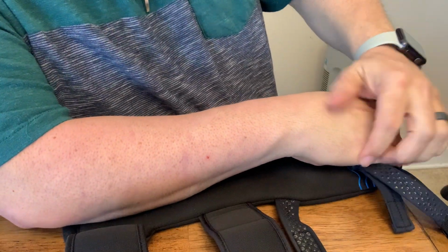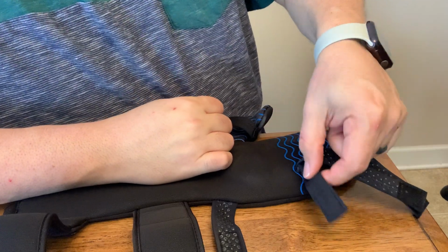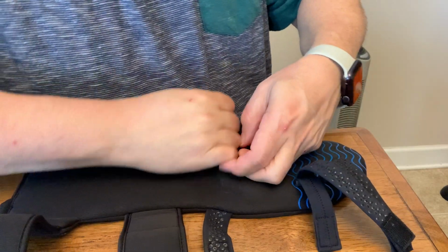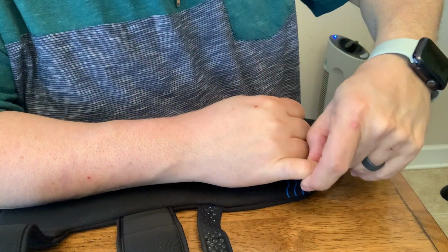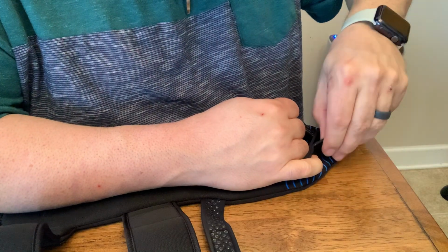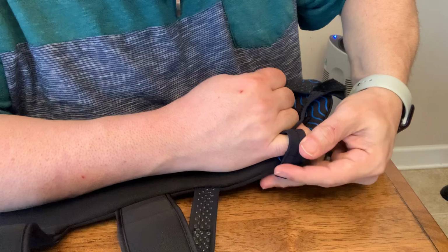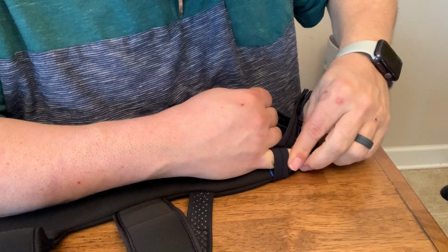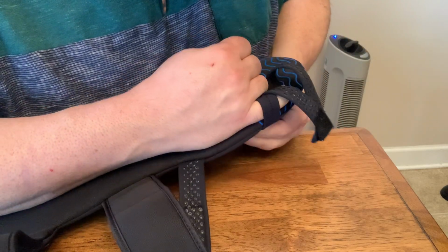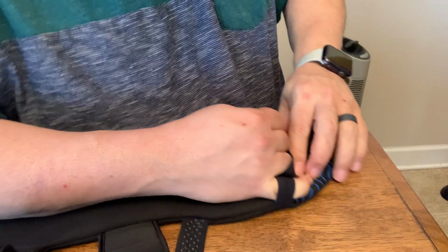For example, this strap right here is your pinky strap. So that's the first thing I do, I go to the pinky strap, okay? I don't worry about my other part of my hand yet. I get this pinky strap in, and then you lift the glove and pull your strap in. Get your pinky in there first. Once the pinky's in there, make sure I've got it nice and tight. Make sure it's all secure.